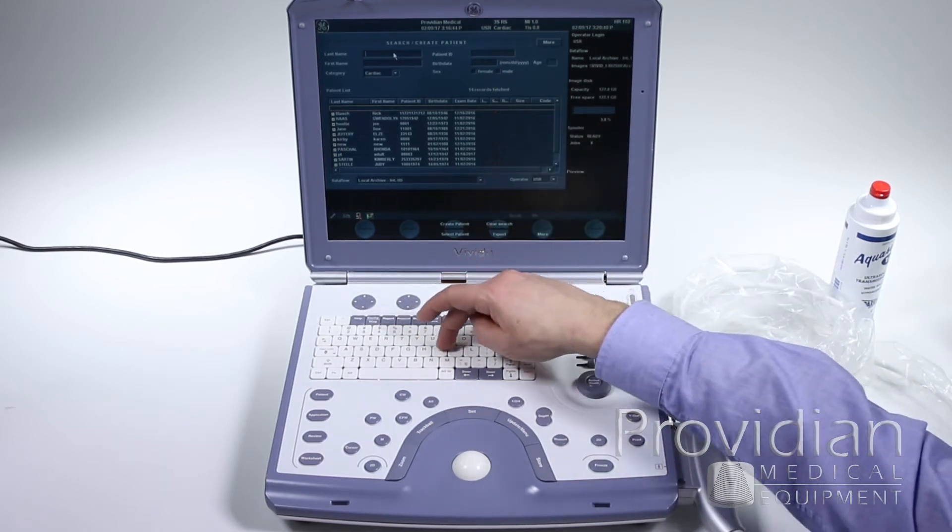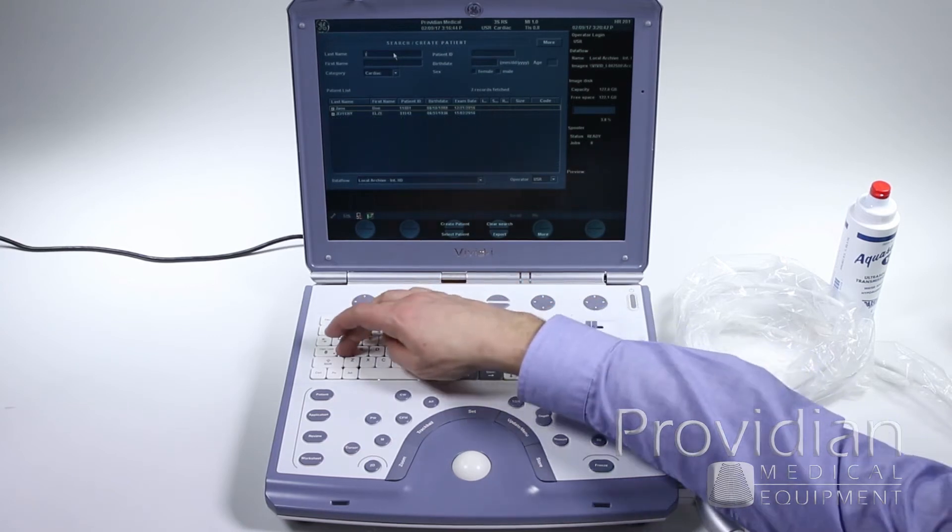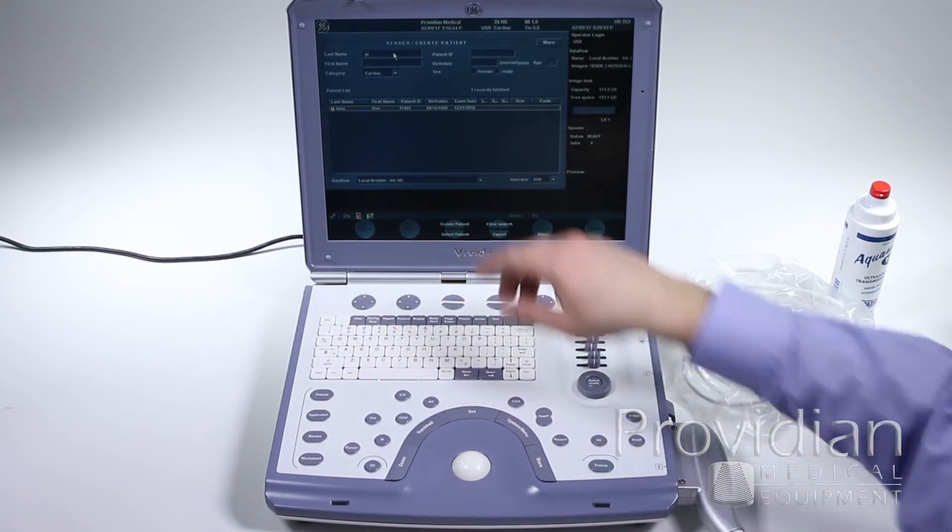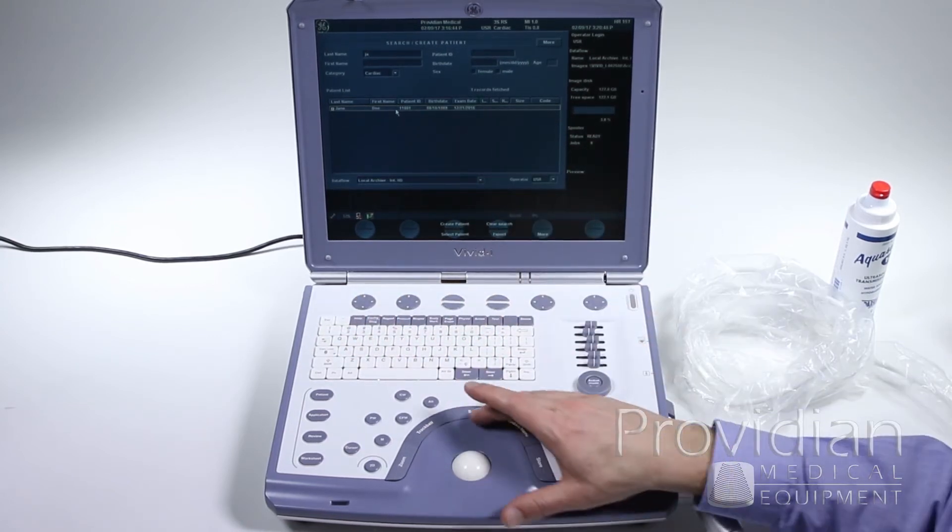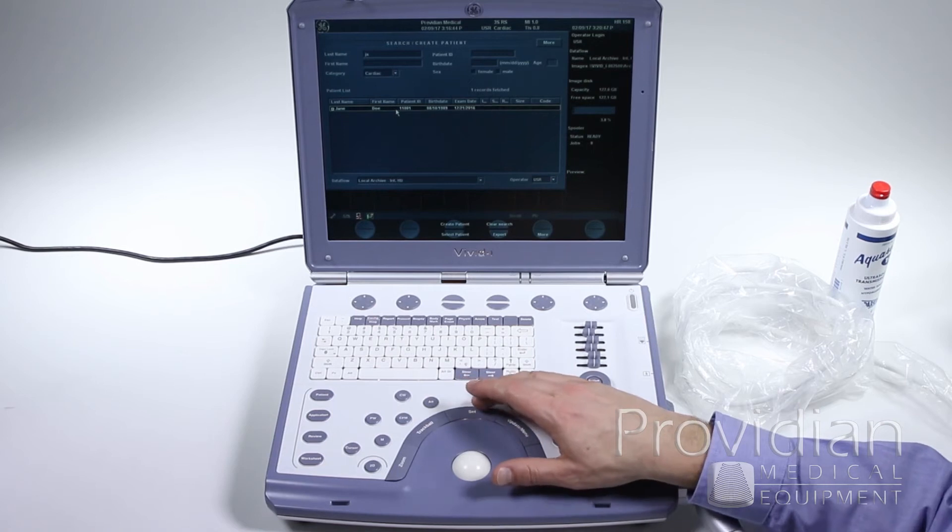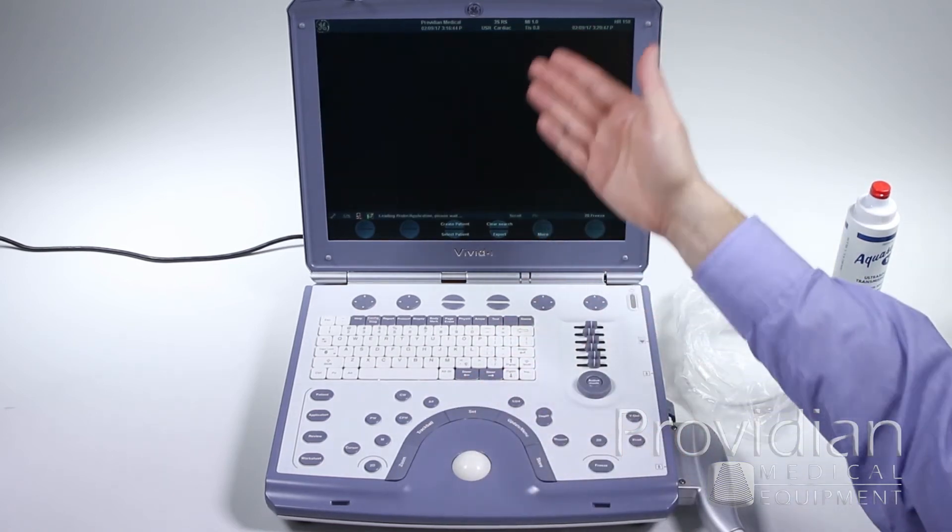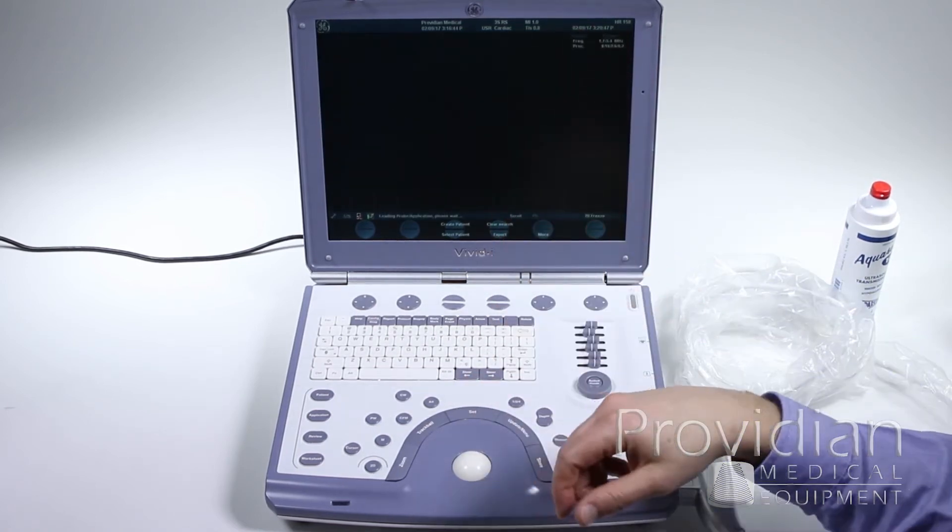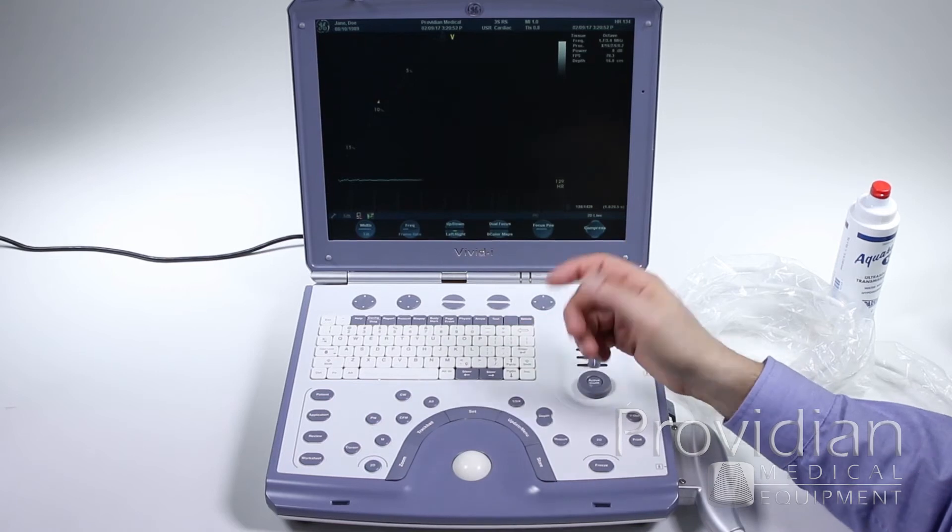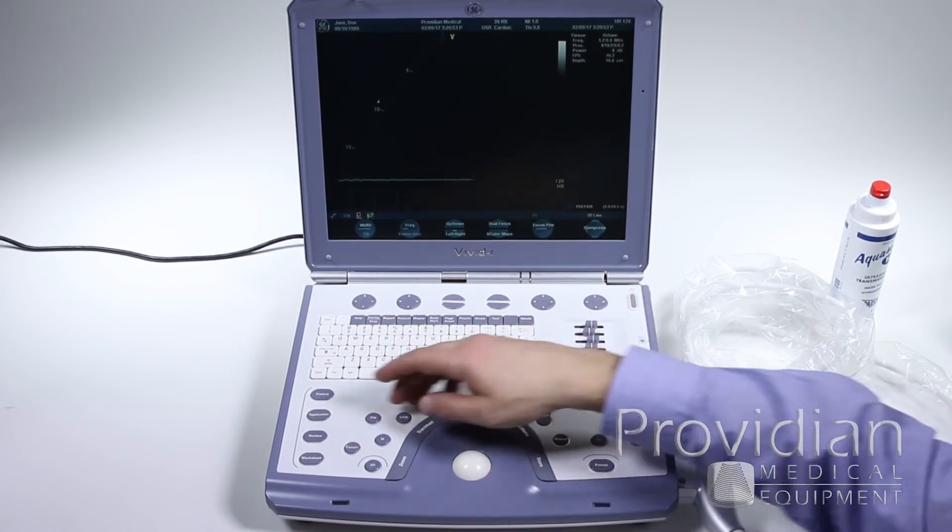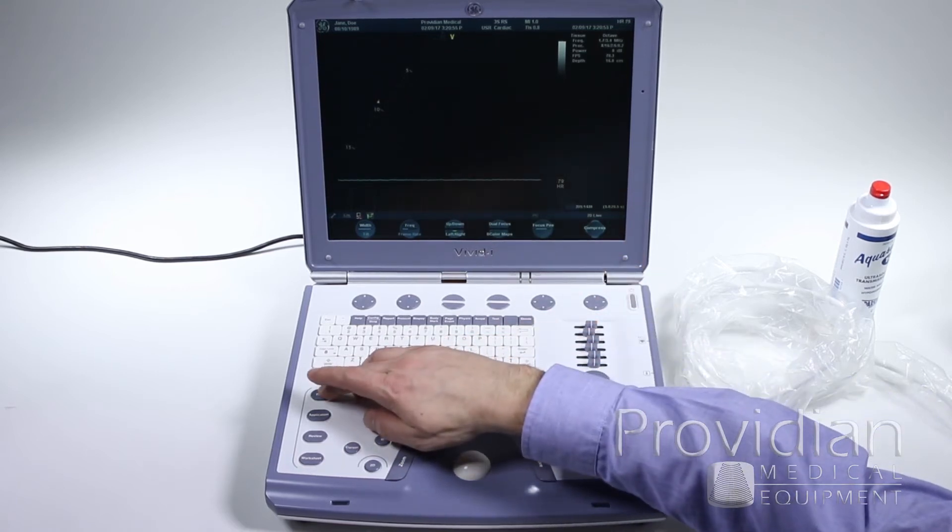we can either search for a patient or create a new patient. So if I just want to search for a previous patient, I can just type it in and here I've got this previous patient. Double-click and it's bringing up that previous patient and starting a new exam. Now that's not really what I want to do here. I'm going to create a new patient.